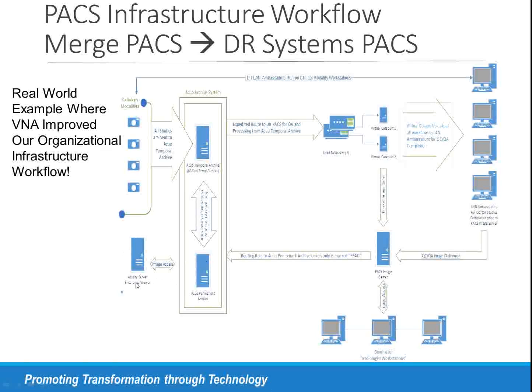All of this, of course, is available from a viewer that exists for image access directly from our EMRs or from a web interface that is available directly into the archive. So any of this can be down over here, and this is all still readily available to us within the archive solution that we have.